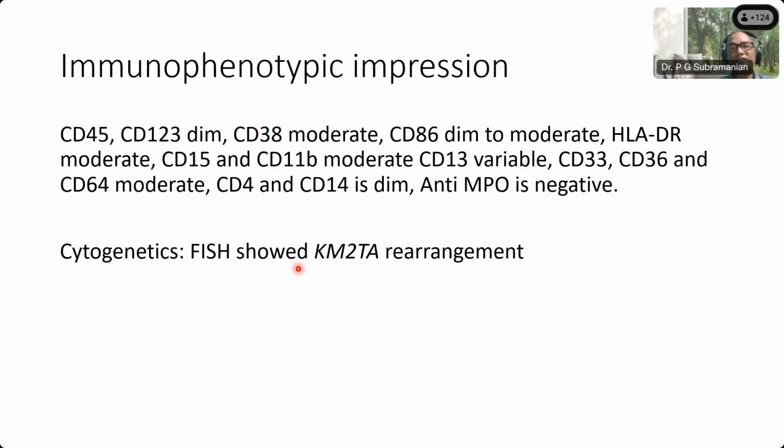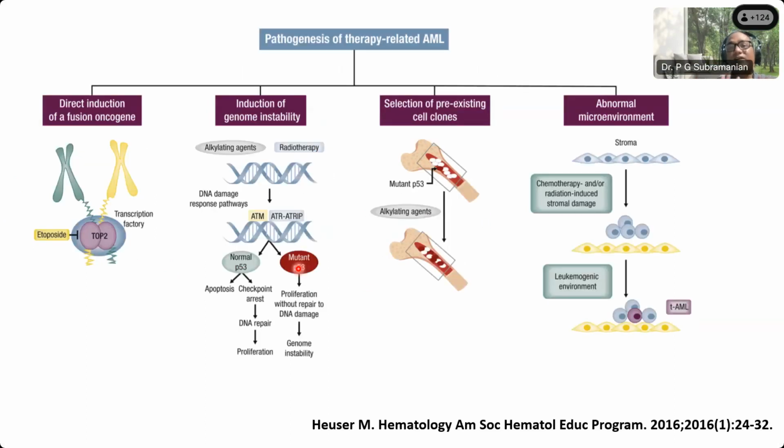So this final diagnosis in such a case we will give, because the patient is already in ALL, has been on therapy for 4 months and has developed an AML which is monocytic. So this would be what we would call a therapy related AML. Therapy related AML is a comment to be given. It is AML, acute monocytic leukemia with MLL KMT2A rearrangement. So it is basically AML with KMT2A rearrangement, therapy related. So that's the way the current diagnosis is there.